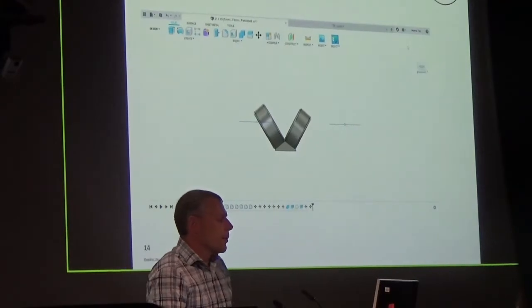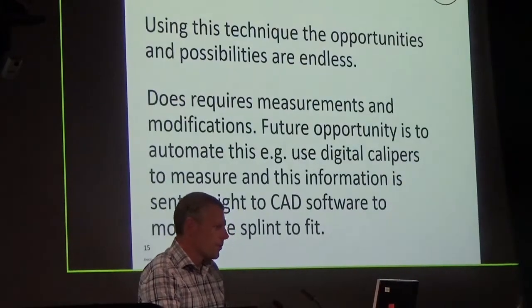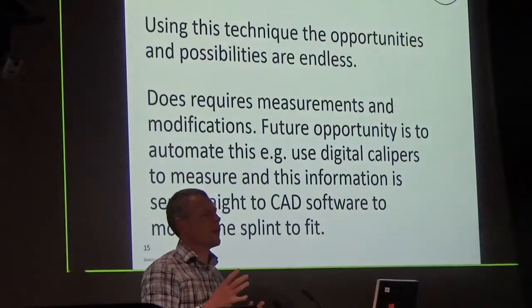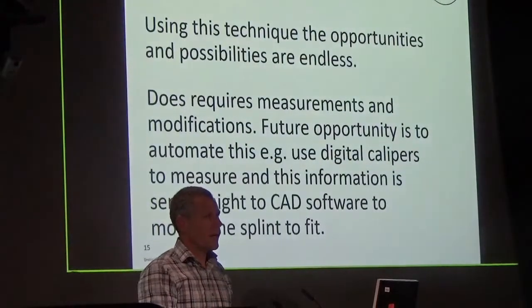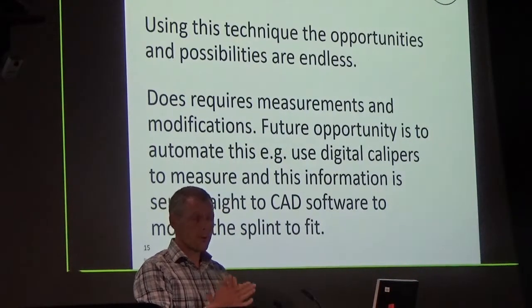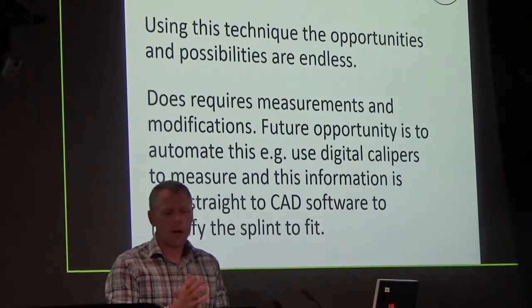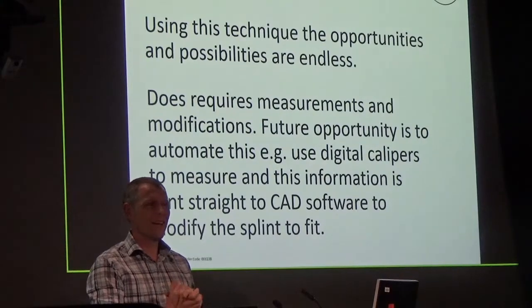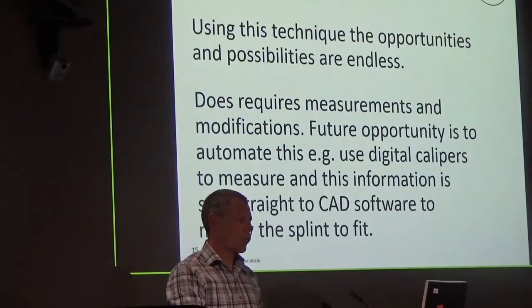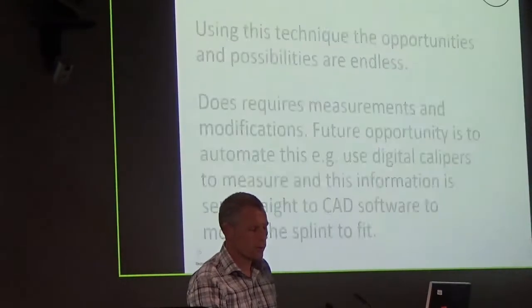So this is modifying a splint through computer-aided design, and an interesting aspect in terms of that is how much design you can change. So really the opportunities and the possibilities to design splints, up until this point, to be honest, we've been limited by the material that we use, what we've been taught to a point, our imagination to a point. Time is always that, but really the ability to change design is significant. We can change it quite drastically, and like I mentioned before, you can actually test it out to see how strong it is.